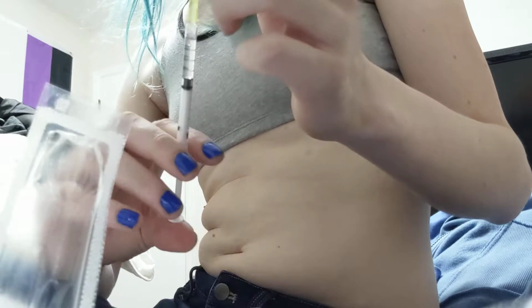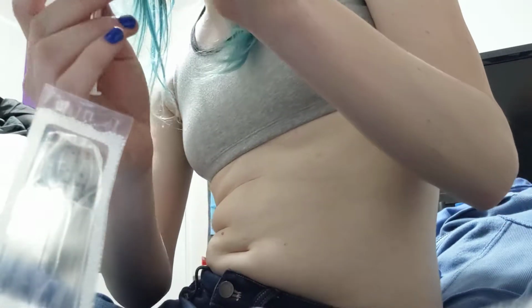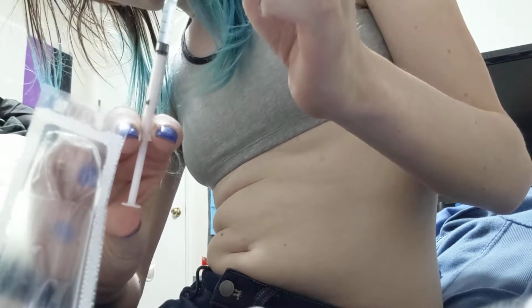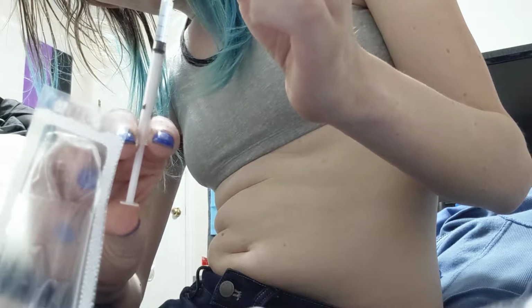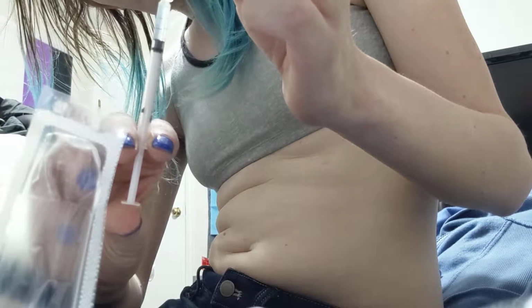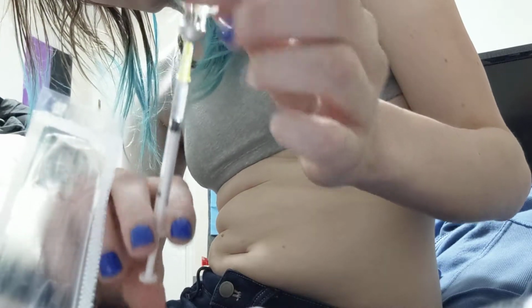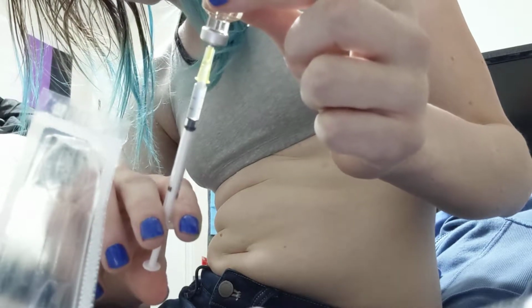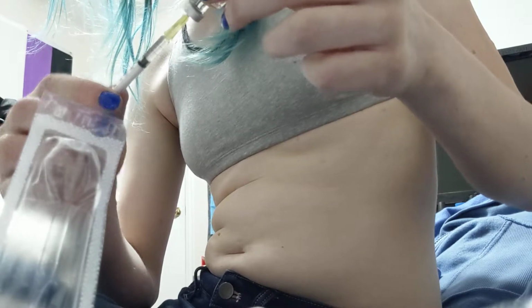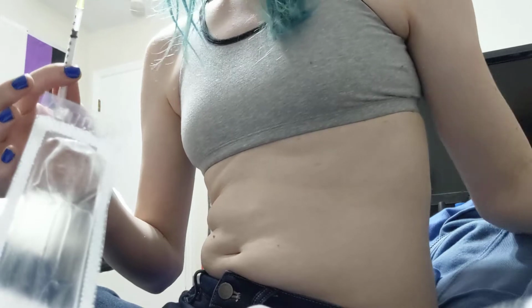Alright, then once it looks like you have about 0.3 mils in there, you want to tap it a little bit if there's any air bubbles on the bottom. If all the air bubbles are at the top, that's fine. You want to push it back up to get all the air bubbles out, and you only have 0.3 mils or however much you have. That ends up in the bottle instead and not in you. Then you want to pull it out of the vial. Put the vial aside.